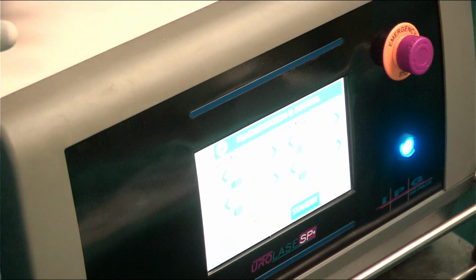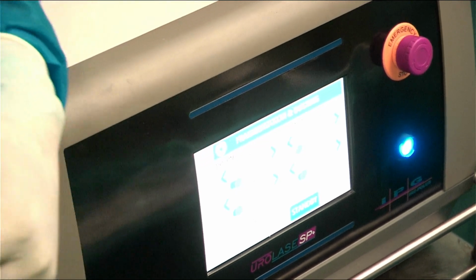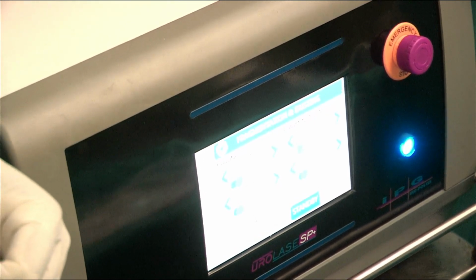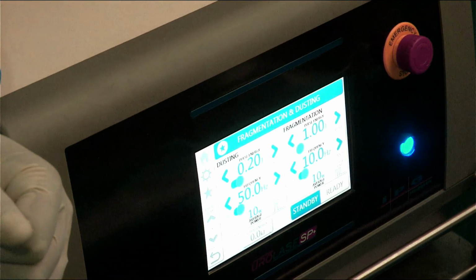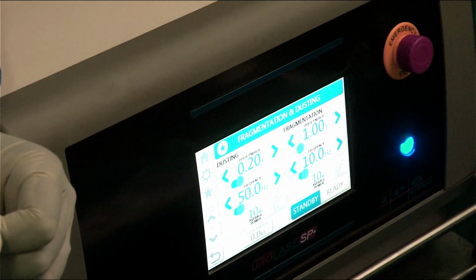Dr. Sajad, may I ask you a small question? Now, with the arrival of the thulium energy system, does that have any advantage stone-wise over the traditional holmium? With the arrival of thulium in the recent past, does it have any advantage in stone management, energy-wise, over the traditional holmium laser? That is my question.